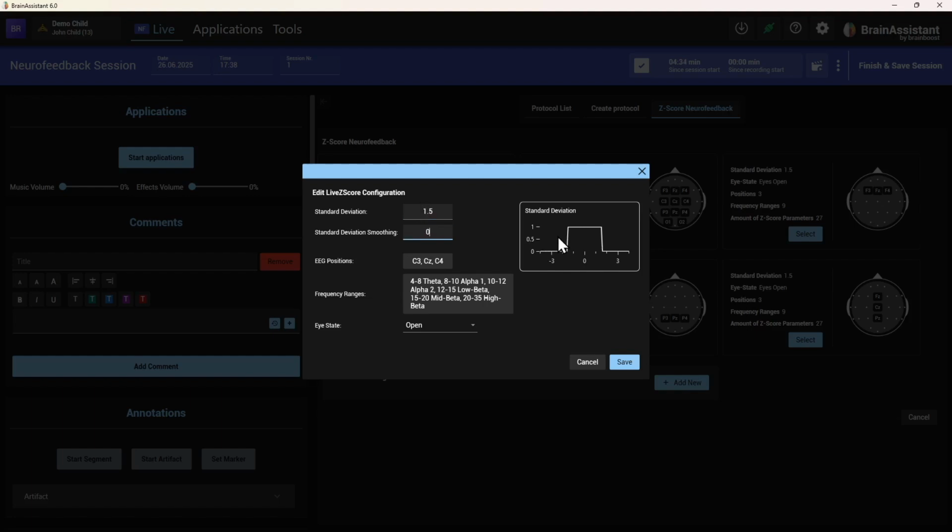This is what I said: when you just have 1 position, 1 frequency band, it will be very jumpy to set the threshold bar with the reward threshold. Now, what we designed is that I say, okay, I don't want an either-or, and I will come to the math behind it with another slide. So just pay close attention, I will explain it.